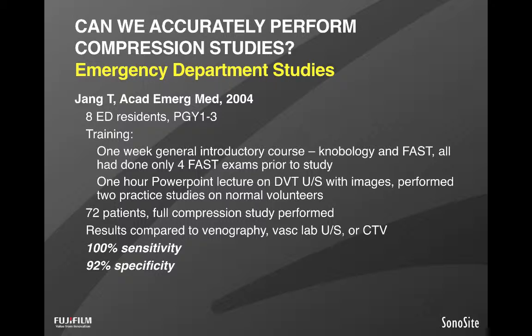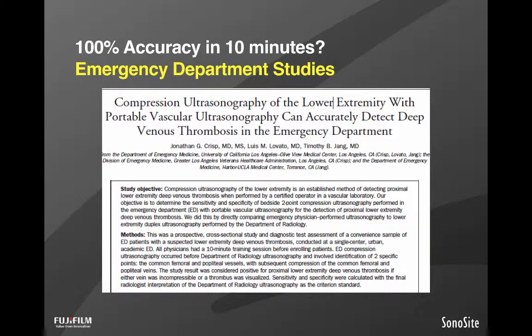Jang also showed this. In emergency medicine, 100% sensitivity and 92% specificity, and that's in a population of 72 patients. Here, the training was a 1-hour PowerPoint lecture, as well as a general introductory course to ultrasound as part of the residency training. This study got a lot of attention because it pushed the envelope as to what you can accomplish with focused training.